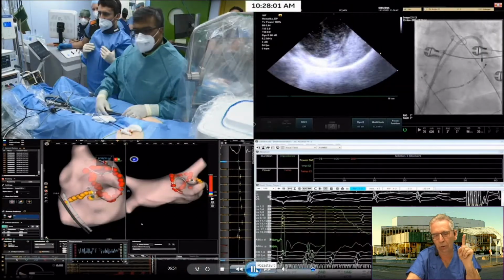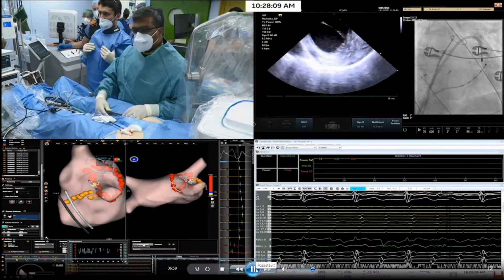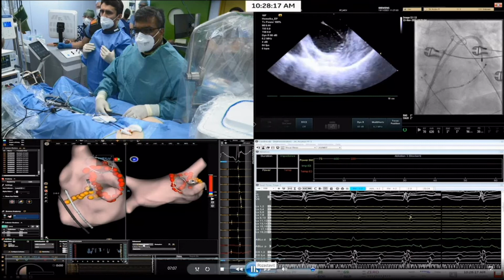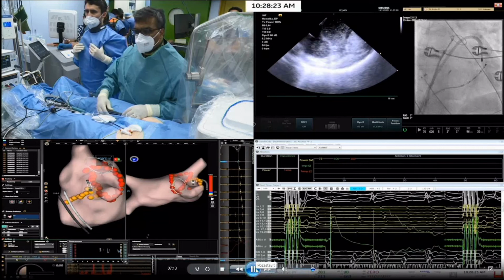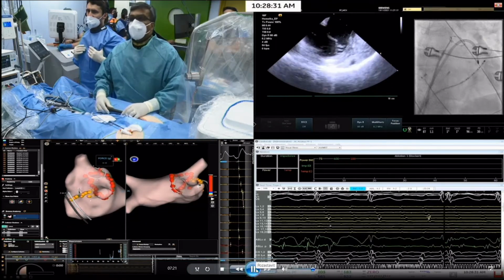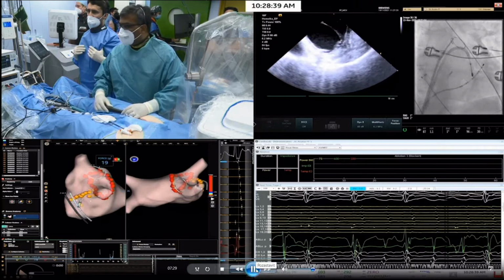So actually, what I didn't mention, and I mentioned during my presentation, is that you can choose the number of pulses. So these 3 pulses, when you are going closer to the ventricle, we didn't know because they were really very first cases. So we decided when we are close to the ventricle, left side, right side, to get a single pulse.